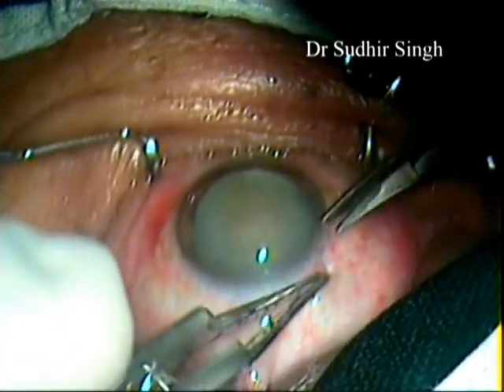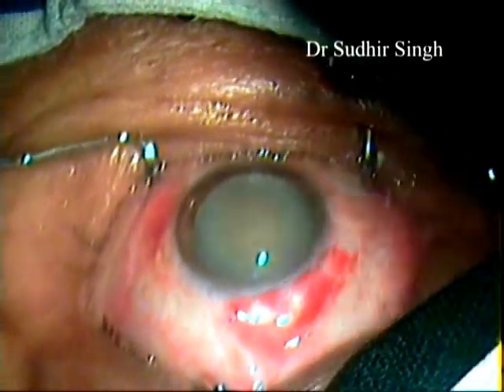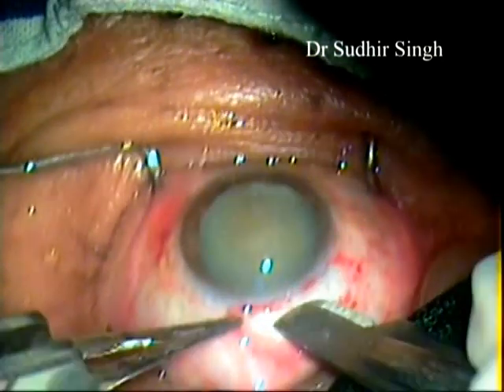A fornix-based conjunctival incision is made in the superior temporal quadrant. A light cautery is applied. A partial thickness groove of 5 mm length is made.